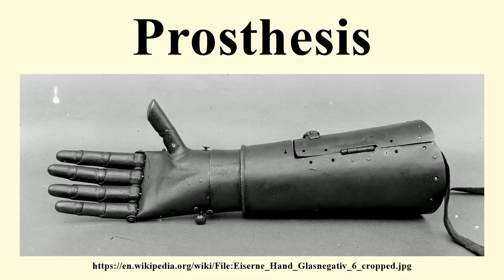Two main types of prosthetics are available. Cable-operated limbs work by attaching a harness and cable around the opposite shoulder of the damaged arm. The other form of prosthetics available are myoelectric arms. These work by sensing, via electrodes, when the muscles in the upper arm move, causing an artificial hand to open or close. In the prosthetic industry, a transradial prosthetic arm is often referred to as a BE, or below elbow prosthesis. Lower extremity prostheses provide replacements at varying levels of amputation.